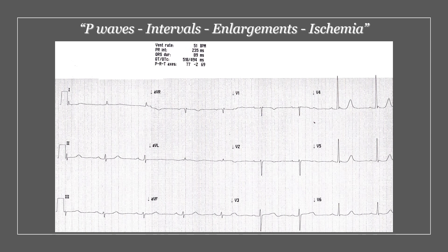Moving on to the P waves, intervals and enlargements and ischemia. The P waves — I can only see one P wave before each complex. Looking at the intervals, the PR interval is 235ms and it's more than five small squares, so the PR interval is prolonged. It is fixed, so that is a first degree heart block. Looking at the QT interval, it is 494ms, so that is on the prolonged side — we've got a prolonged QT interval.